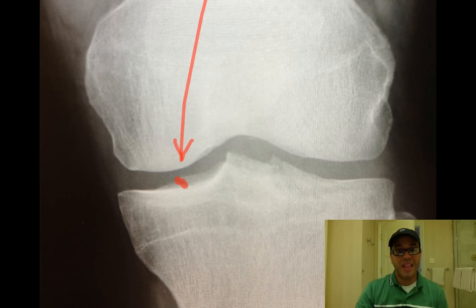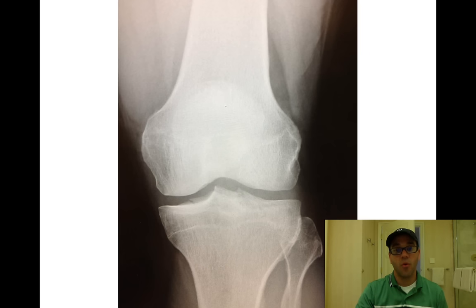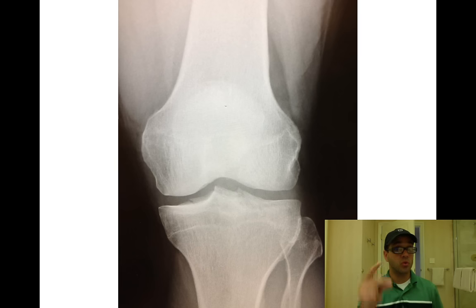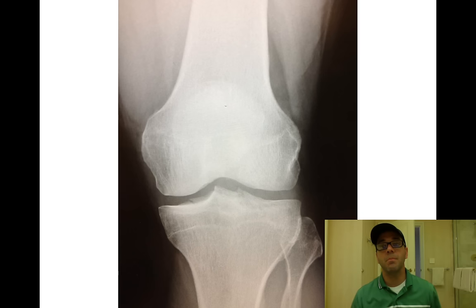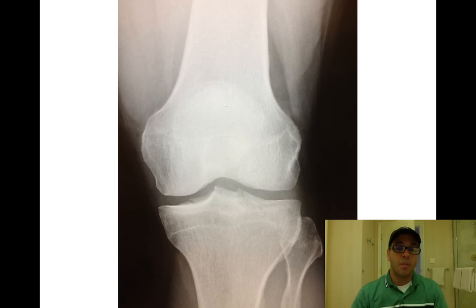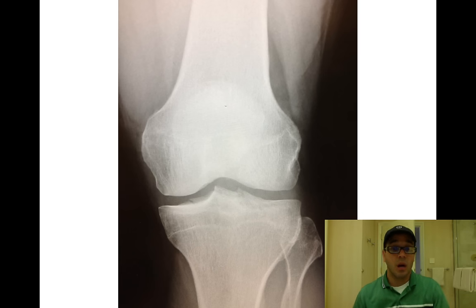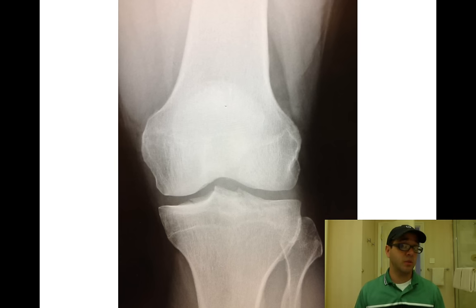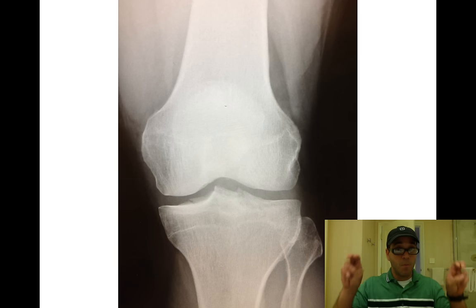That line right there is a tibial plateau fracture. Now, on the original X-ray, you can clearly see the shadow of the effusion increasing your suspicion, and then you find the fracture on the medial plateau of the knee. This patient definitely needs orthopedic referral. Initial ER management is typically a knee immobilizer and crutches. Most of the time orthopedics will see them in the office within a few days.